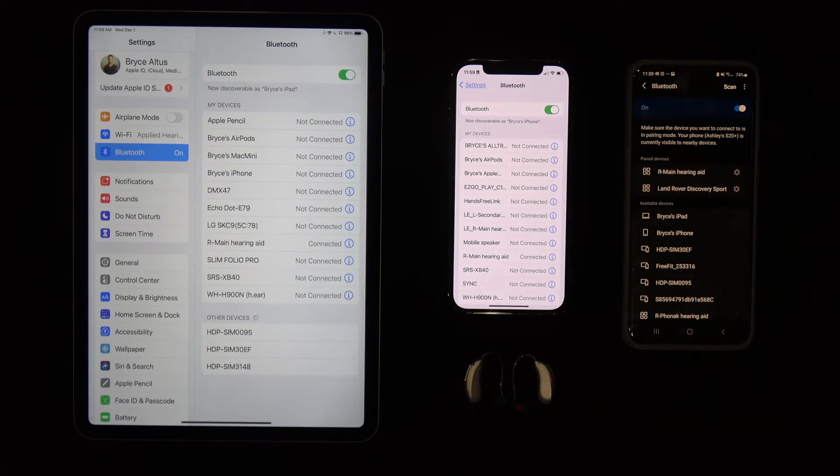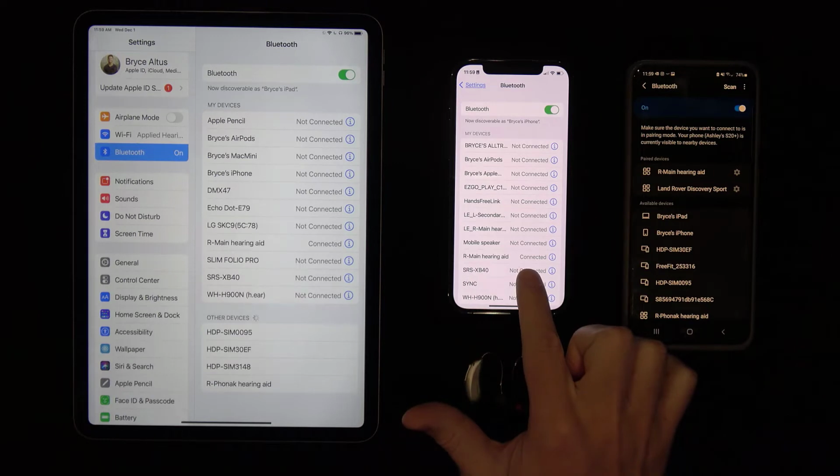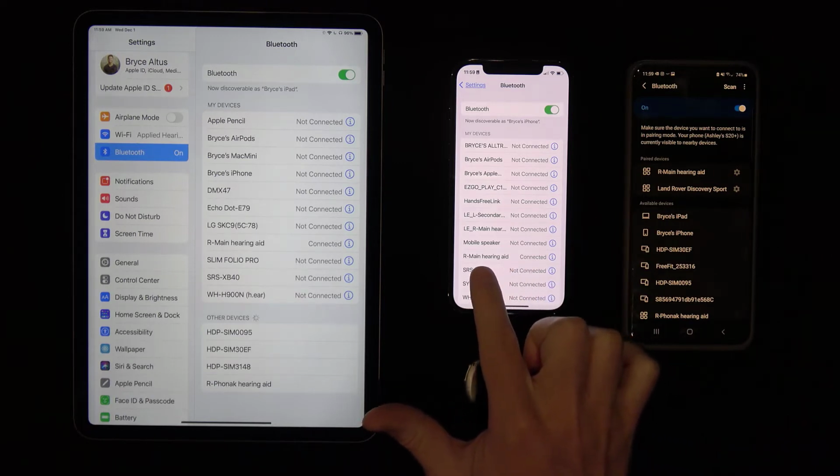To the right of the device name or below the device name, you should see either the word connected or not connected.